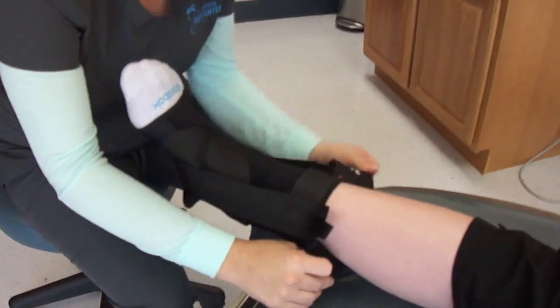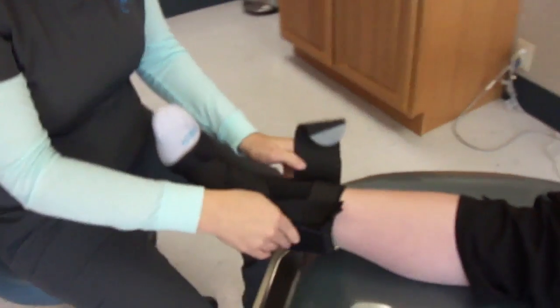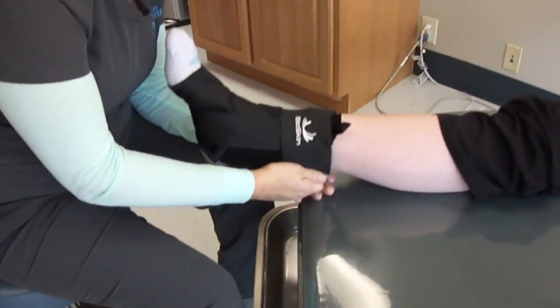And then you're going to take this piece here, pull it down around. This is to hold everything in place.